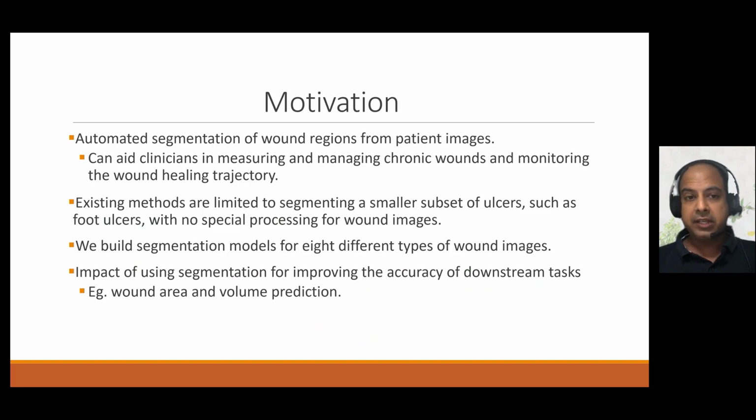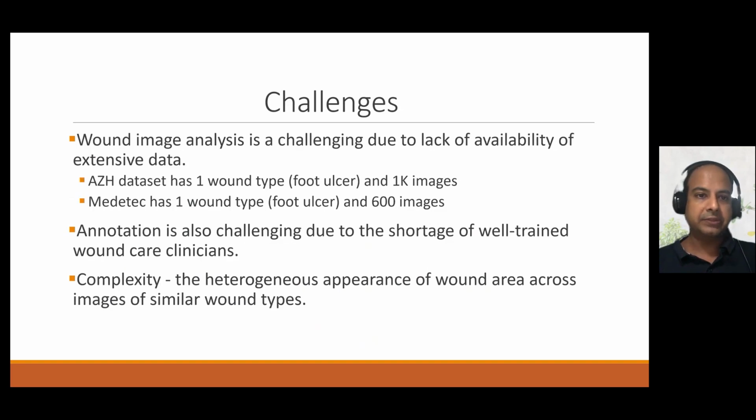In this work, we build segmentation models for 8 different types of wound images. The impact of using segmentation for improving the accuracy of downstream tasks is really nice. So we in fact show results on wound area and volume prediction.